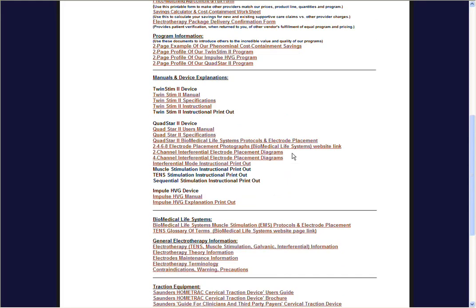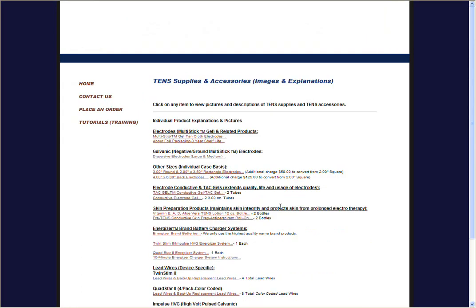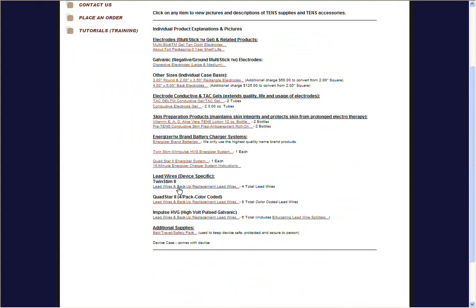So again, depending on which device you have, you're going to go, and then again, with the TENS supplies details, I'll go over a couple additional supplies. Obviously, you're going to use electrodes to put on the muscles that you're working. You're going to possibly use the 2-inch square electrodes.